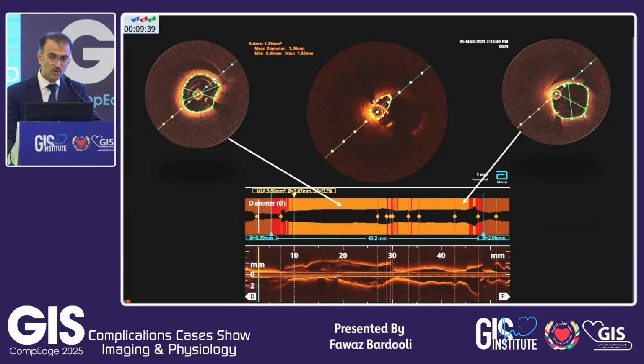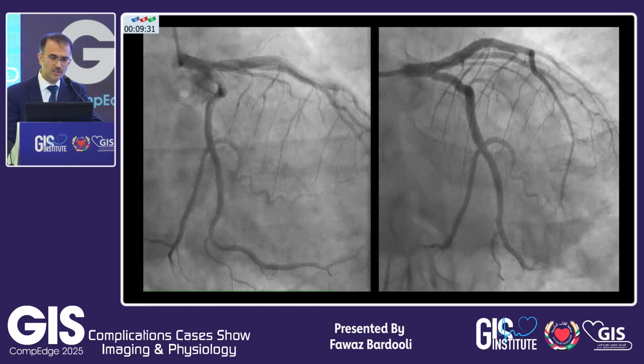OCT for me. So I left the patient on medical therapy, stays for 3 days in the hospital, brought him after 3 months for a checkup angio, and that's it. Saved the patient from a stent, actually saved the patient from being dead now.